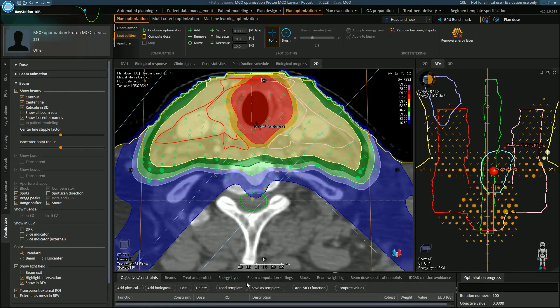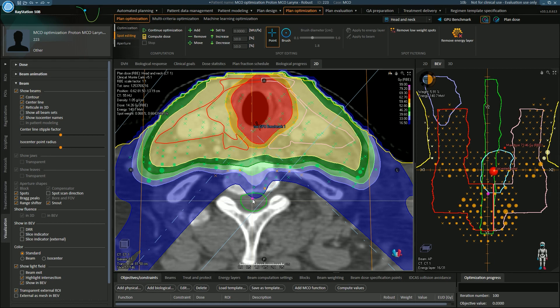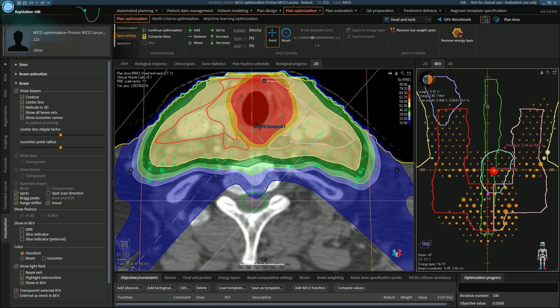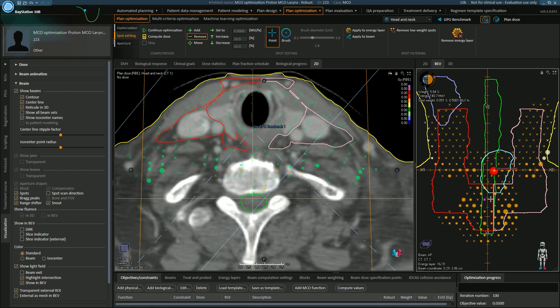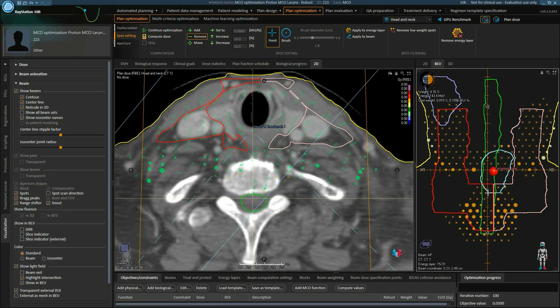There are some great tools to make adjustments after optimization. For a very minor adjustment, we have spot editing tools. As you can see, there are Bragg peaks that fall in the spinal cord, which is not what we would like. I can select the Bragg peak and view it in the beam's eye view — it's highlighted in purple. I can then choose to remove the spot. So I can remove this one, and then I can remove it here.